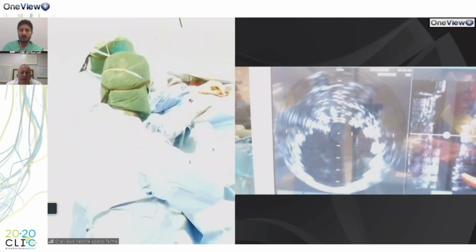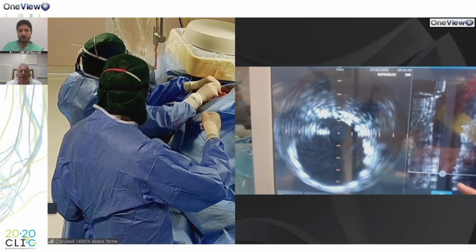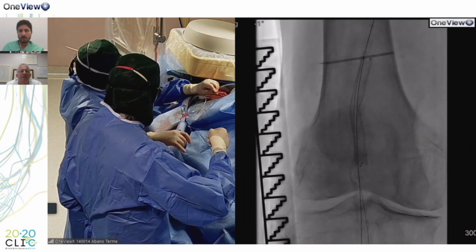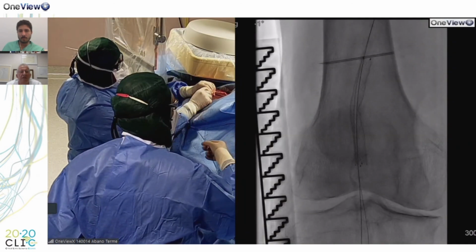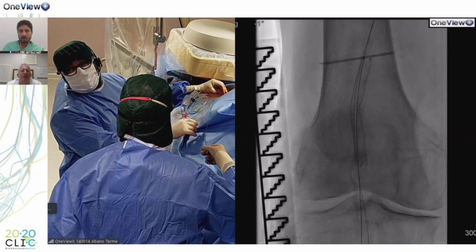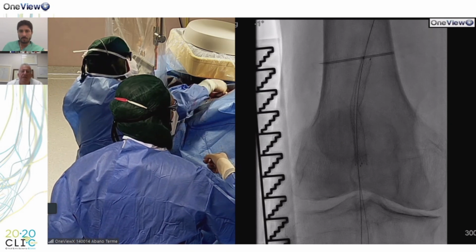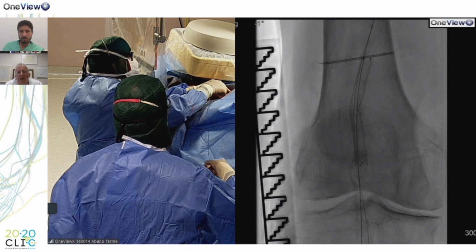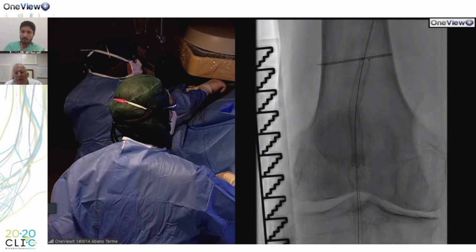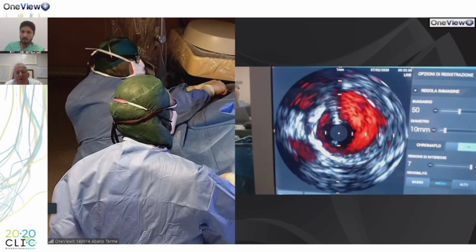What do you think, Roberto? Okay, it's a good position. I would question Marco if he has the chroma flow in the software for the IVUS. Abbiamo il chroma flow, sì. Per fare il chroma flow devo ripassare? No, it's correct, but you look at the little stenosis just in front of the patella, and I think that the IVUS.